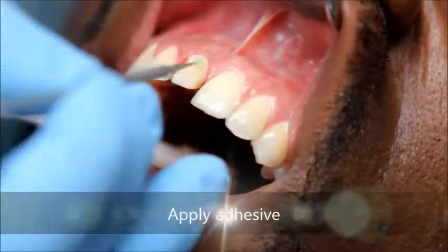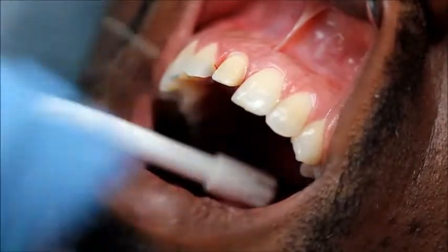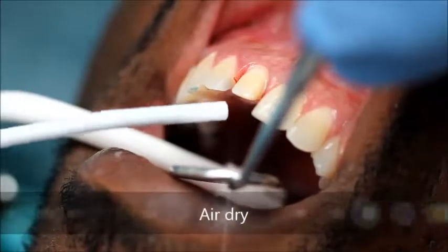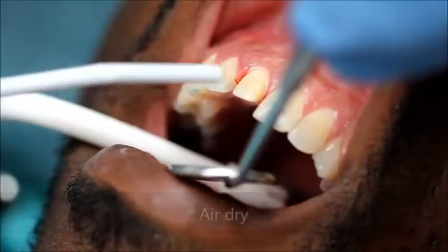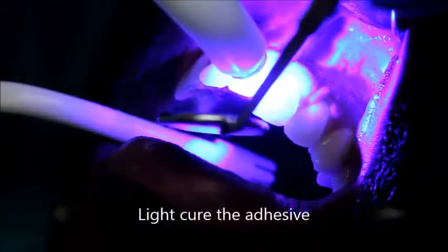A one-bottle fifth-generation adhesive is applied to the tooth surface. The adhesive is then air dispersed, ensuring there is no pooling of the adhesive — particularly at the margin — that would prevent the crown from seating. The adhesive is then light cured for 20 seconds on both the facial and lingual surfaces.